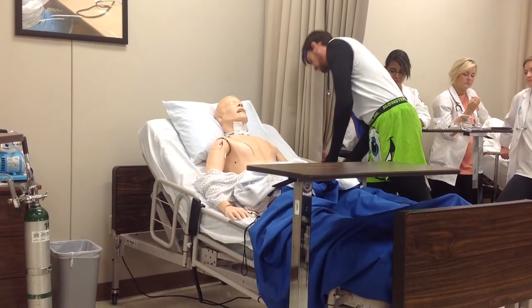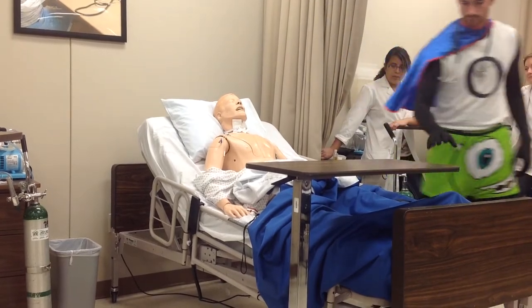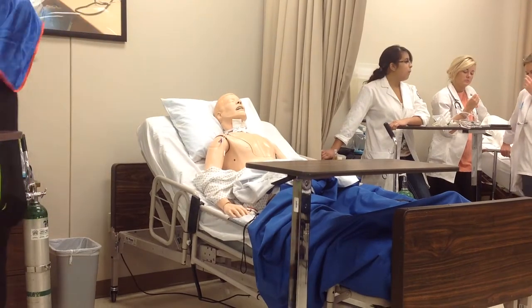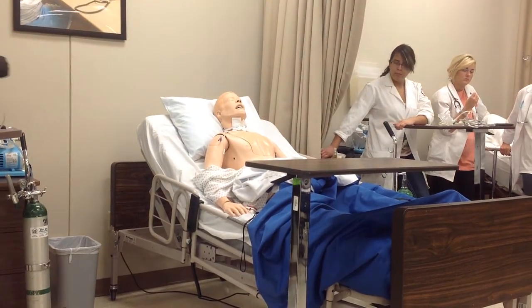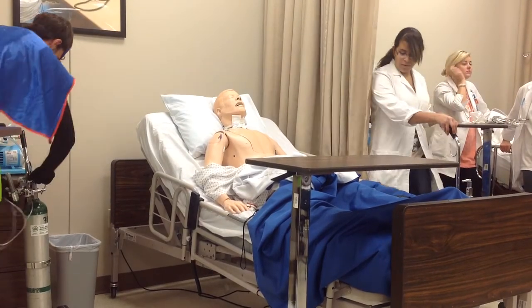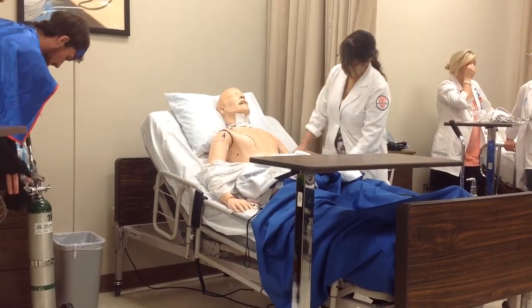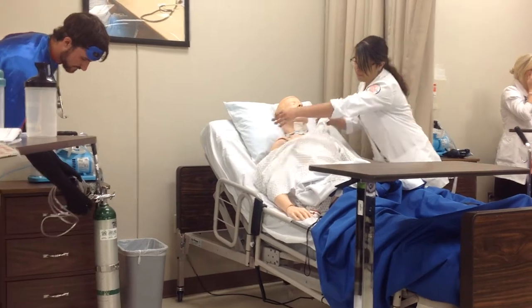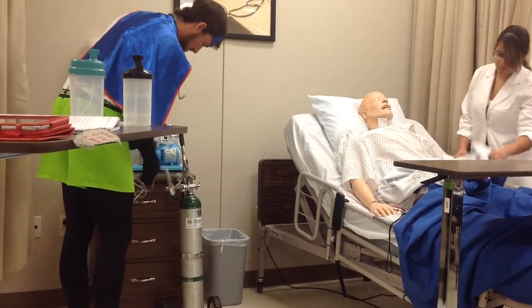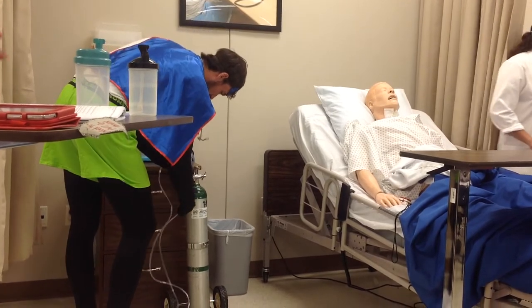Once you've done your first full assessment, you're going to check your oxygen equipment. You're going to set the correct flow, it's on the app. And you would check your doctor's order if you need humidification or not. And since you don't, this one needs a little Christmas tree adapter. It's that little green triangle. That's where you're going to put your O2 device on. So you're going to set the dosage.